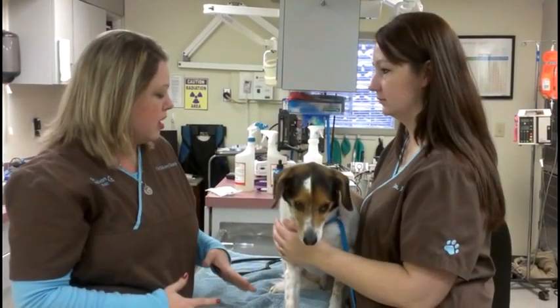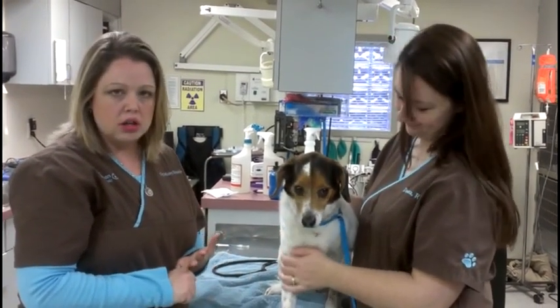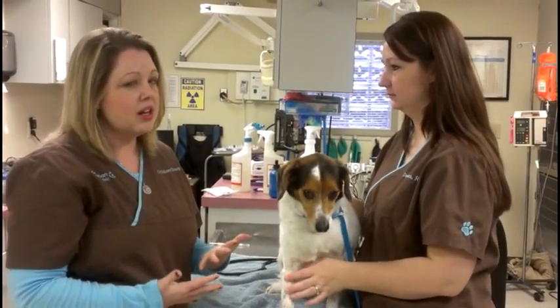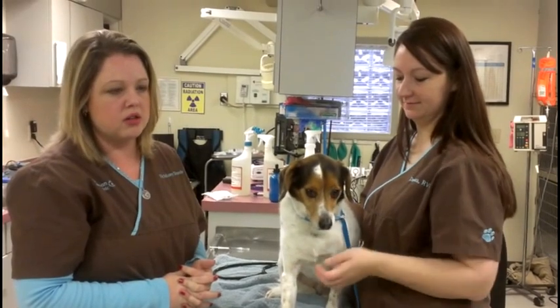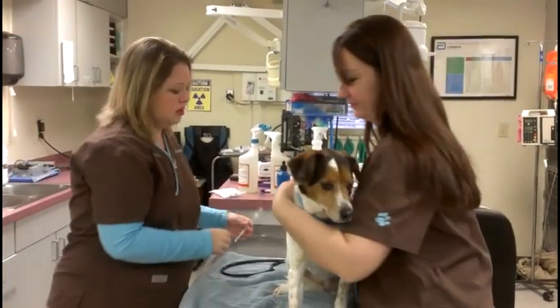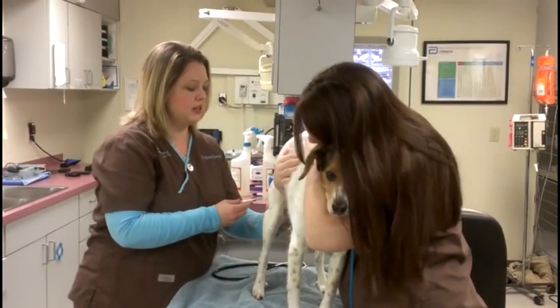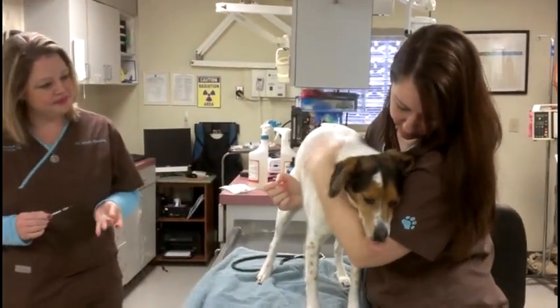So at this point in time, since she has normal blood work and her heart and her lungs sound good, we're going to go ahead and give her a pre-medication. Kind of like a sedation to just take the edge off, make her calm down so that we can get an IV catheter in. It's just a quick poke, and then we'll give her about 10 minutes for that to make her nice and relaxed. Oh, Mabel. Good girl.